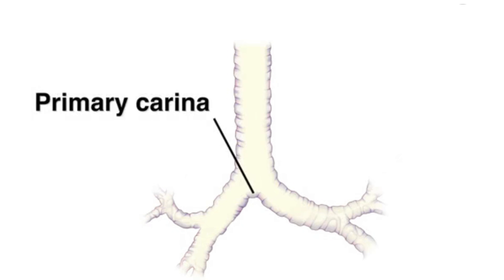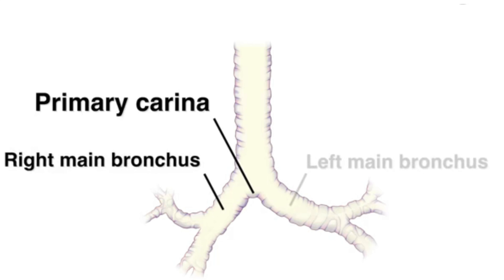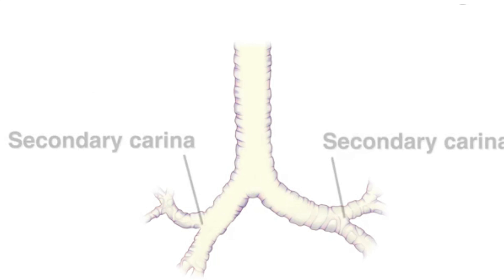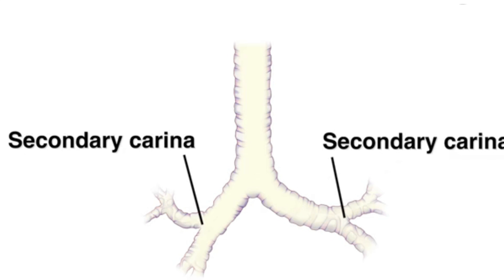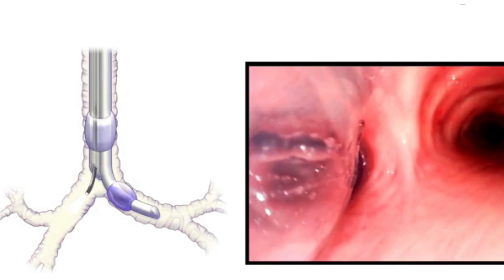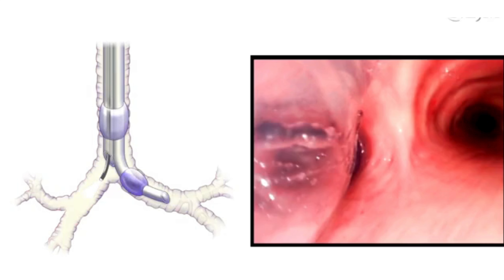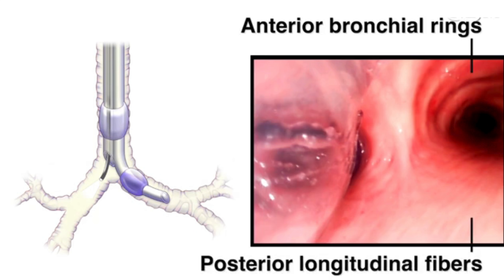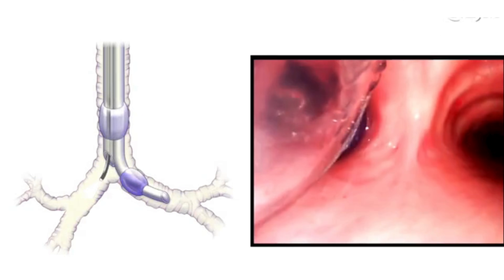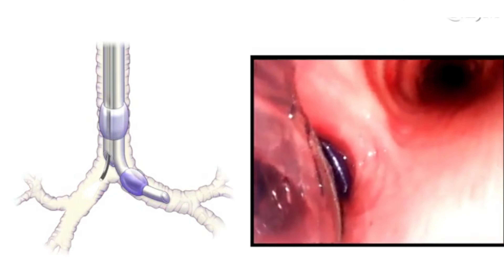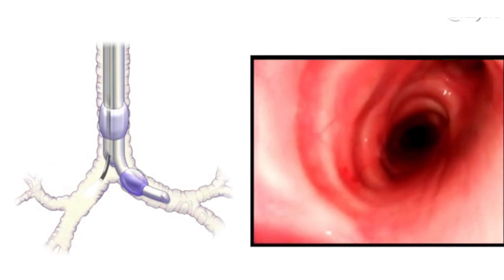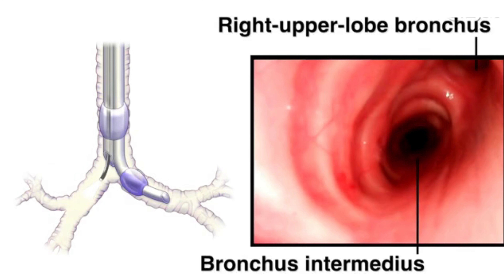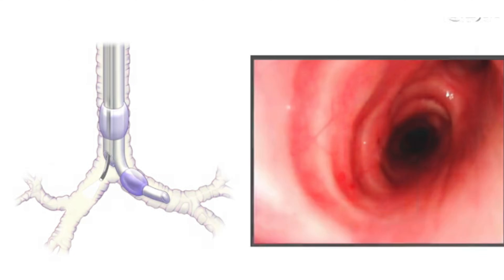Make sure to differentiate the primary carina — that is, the carina associated with the takeoff of either the right or left main bronchus. Various anatomical structures can be used as reference points. For example, visualization through the tracheal lumen of the cathedral-shaped bronchial rings anteriorly and the longitudinal fibers posteriorly can assist with left-right orientation. The right upper lobe bronchus and the bronchus intermedius, which divides into the right middle lobe bronchus and the right lower lobe bronchus, should also be visible and can help to confirm orientation.